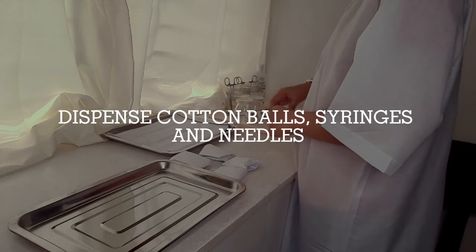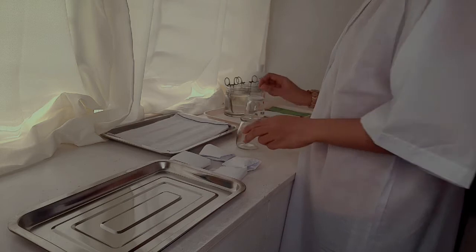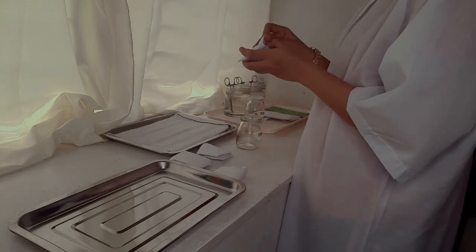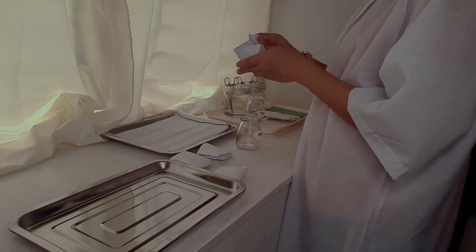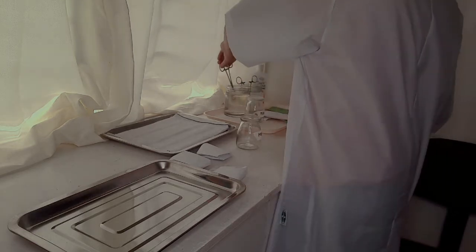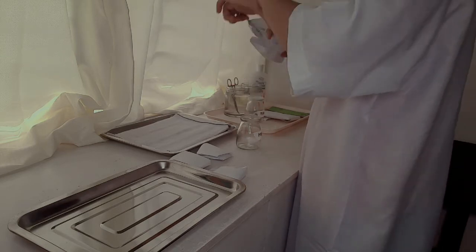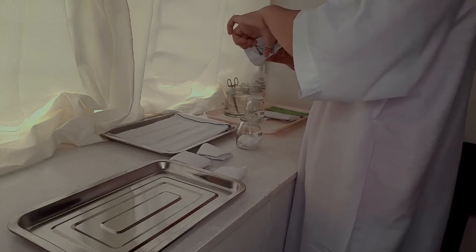Dispense cotton balls, syringe, and needles. Prepare cotton balls in jars and wet one jar with 70% isopropyl alcohol. Notice how the back of the cotton ball is open. Transfer the cotton balls to the jar. Of the 5 packs of cotton balls, 3 are for the wet and 2 for the dry.